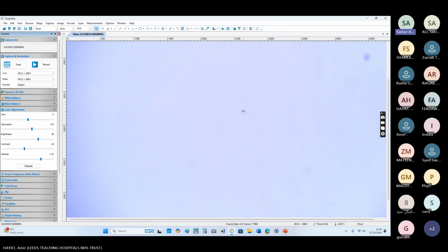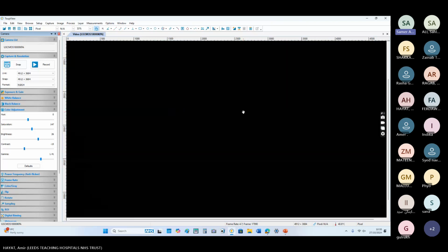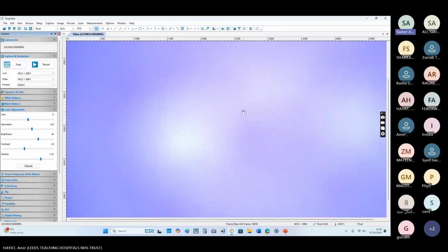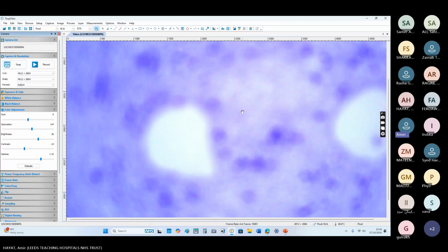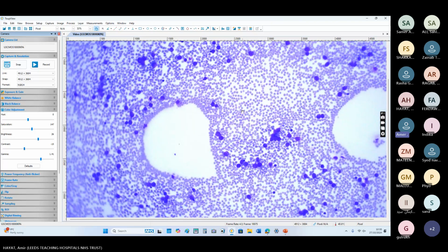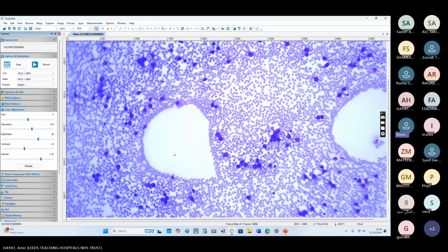So you will describe this blood film findings as medium to large sized cells with a cerebriform nuclear appearance, most likely consistent with a lymphoma. We need flow cytometry to confirm this diagnosis.